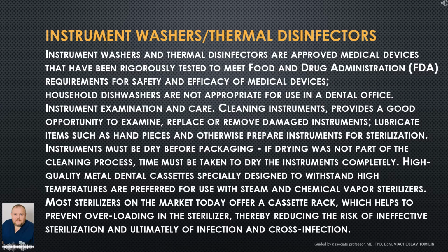Instrument washers and thermal disinfectors are approved medical devices that have been rigorously tested to meet Food and Drug Administration requirements for safety and efficacy of medical devices. Household dishwashers are not appropriate for use in a dental office.